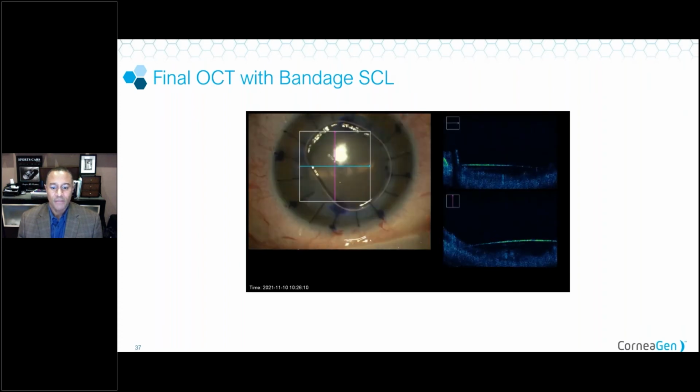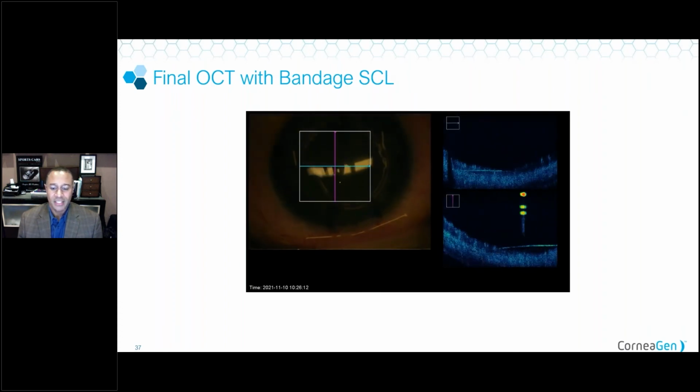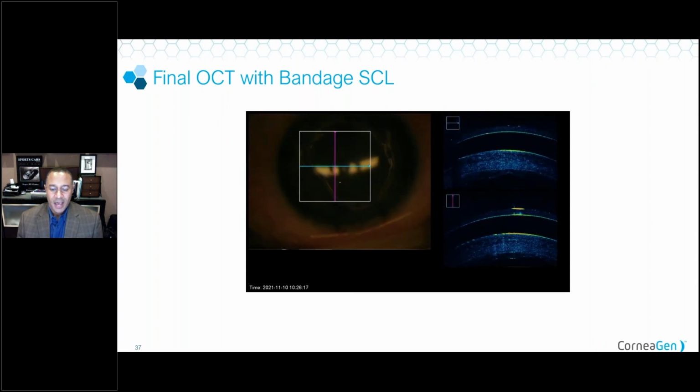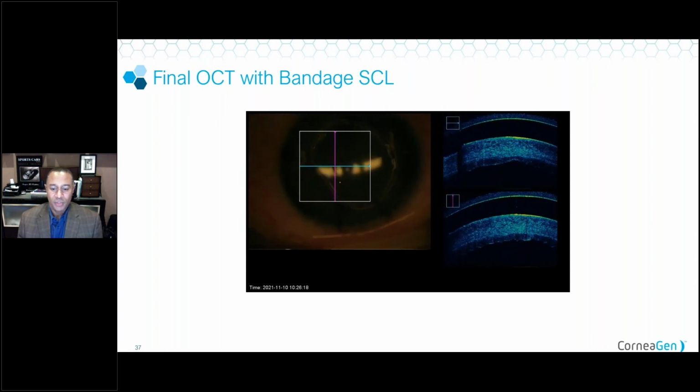So here's our final OCT with the bandage contact lens in place. Again, to show the apposition between the donor and the recipient and the relative thickness of the contact lens in respect to the donor cornea, which we know is 400 microns, and the recipient cornea, the recipient bed, I should say, which we know is, in this case, around 150 to 160 microns.